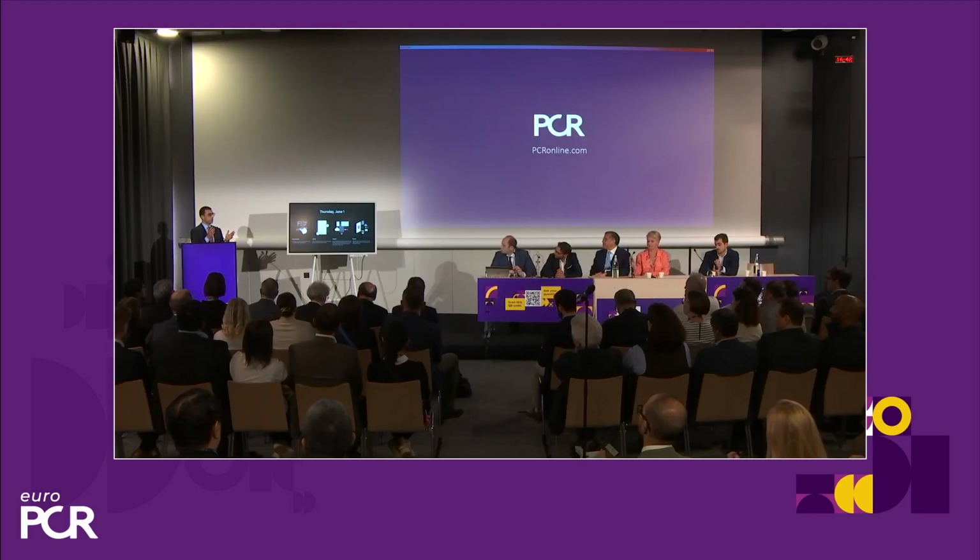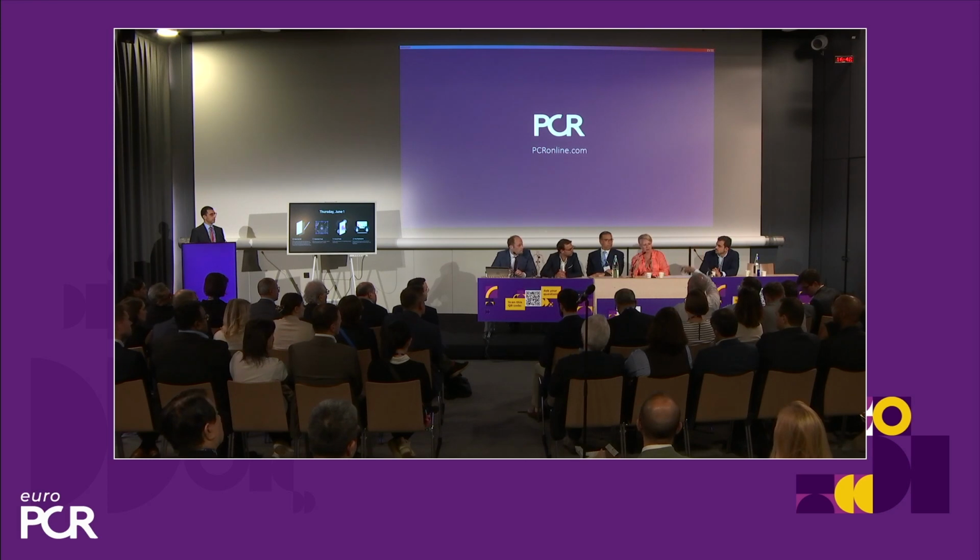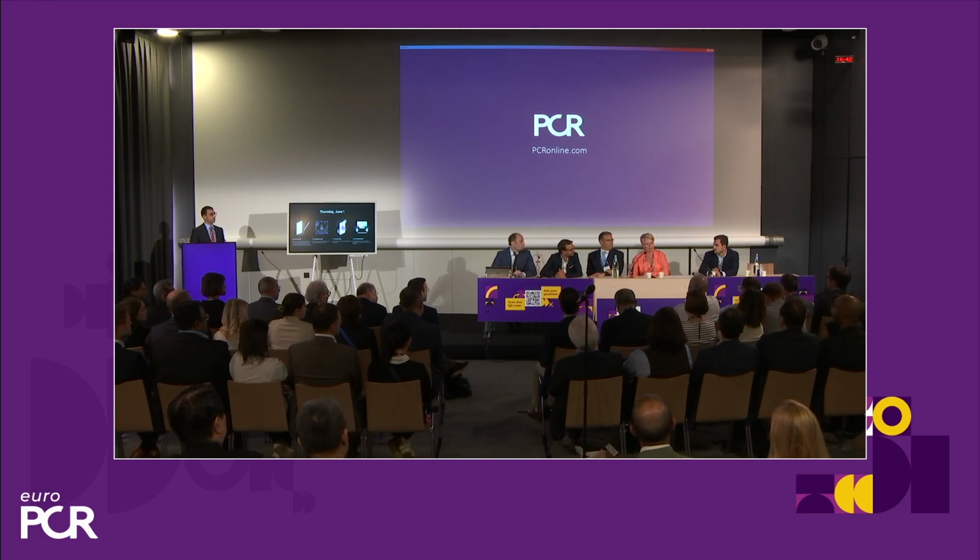The most important thing is that you take the correct projection because, of course, if you have some foreshortening, you are reducing the reliability of a QFR. So take a good projection, make a good injection. Make sure that you have a frame rate of 15 at least, and that's it. And sometimes it's more accurate than FFR. So maybe FFR is not a good comparison. I will show you a case of a tortuous LAD where I think for FFR you would have had a false positive because it straightens the vessel too much.